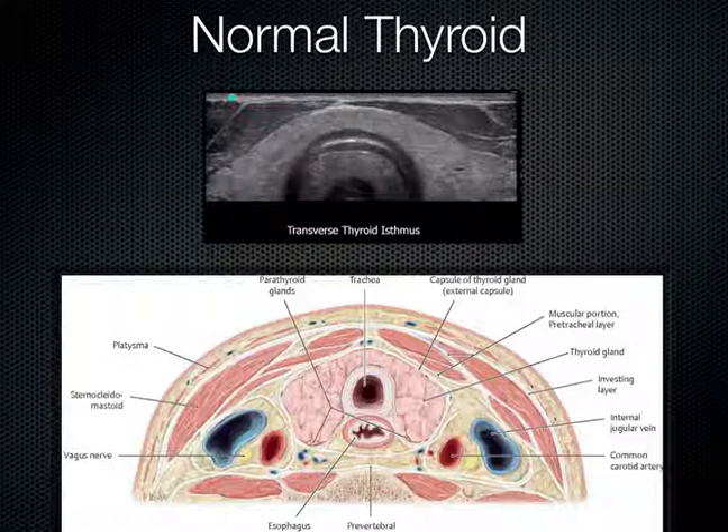This is what a normal thyroid looks like. We can see the trachea right here, and we can see the right thyroid, the isthmus, and then the left thyroid over here. The corresponding diagram is seen down here with the trachea and the esophagus posterior — though I often find the esophagus a little bit left of midline. We can make out this thyroid as it goes all the way across pretty easily with ultrasound. Because it's so superficial, it really lends itself well to using the high-frequency linear probe, which gives us really nice images.